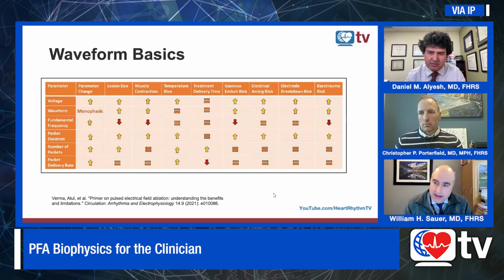The only other thing I would say is that in the experiments that I've seen and performed, there's a limit. If you give 2 applications, does giving a third give you a deeper lesion or a more permanent lesion? Probably not. Does a fourth, does a fifth? There's definitely a plateau effect, and so that's also something to consider. And as we stack more and more lesions on top of each other, you'll have heating, and then you're going to run into that heating problem with the coagulum and char. So I would just be careful with delivering lesions and stacking them on top of each other.